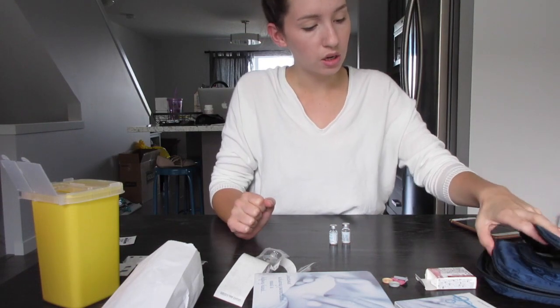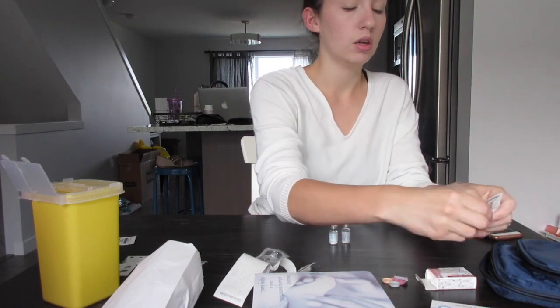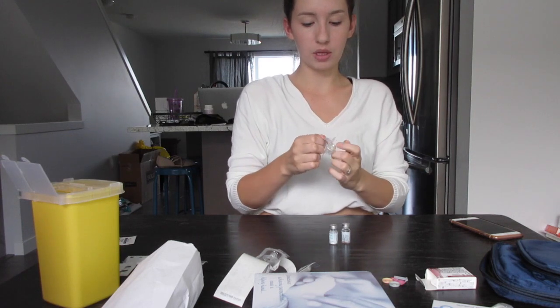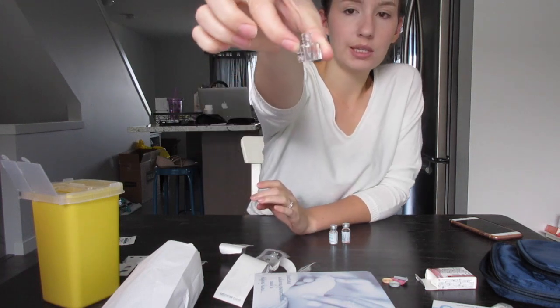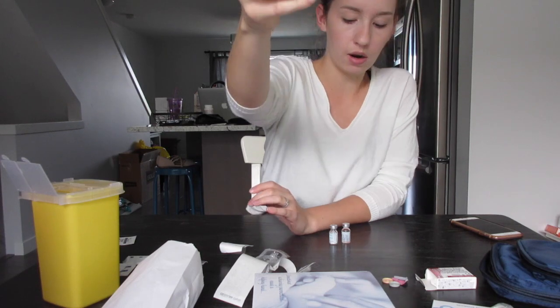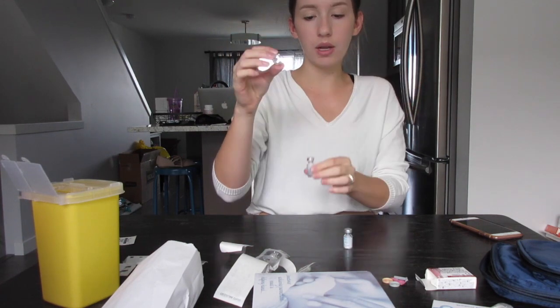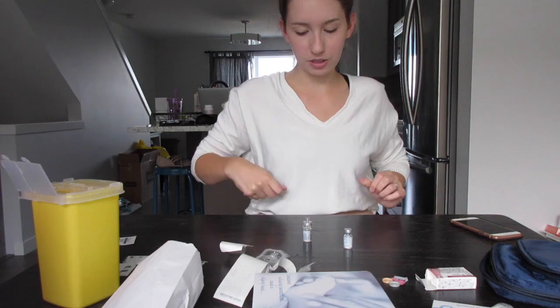The other thing that you need for this one is, because you are mixing it, you need what's called a Q-cap. So this tool is purely just for mixing. So again, I like to open it. It's just this little screw on top where the syringe screws here, and you put the vial in there. So what you're gonna do is place it on the water or the liquid solution first. So what I like to do is just pop it on there. It might shoot out a little bit of liquid, which is always funny.